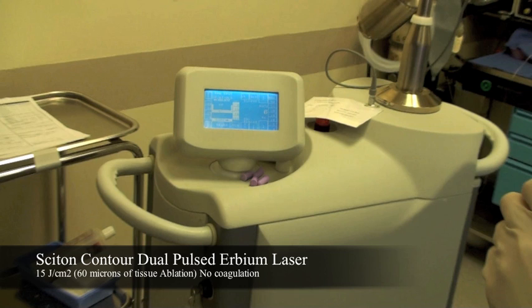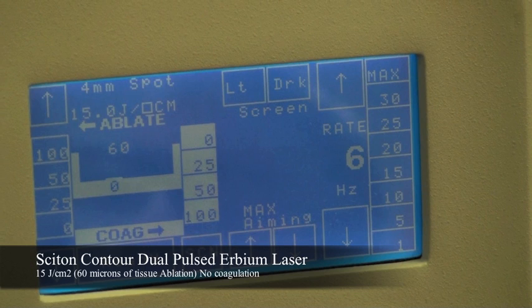This laser has the ability to fire two laser pulses. One pulse causes tissue ablation by delivering fluences above the ablation threshold, and a second pulse fires energy that can be set at variable levels below the ablation threshold. The second pulse interacts with the tissue to create thermal energy, which translates to collagen and tissue tightening, which the laser company refers to as coagulation.